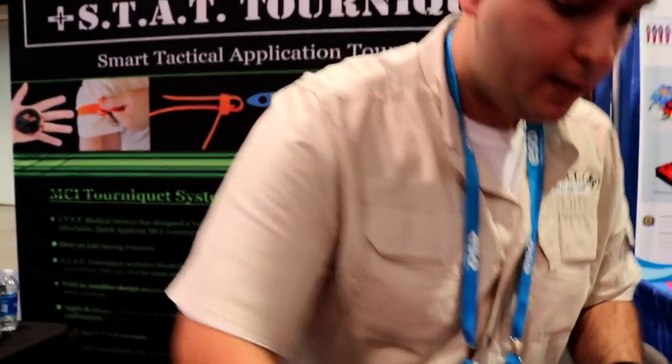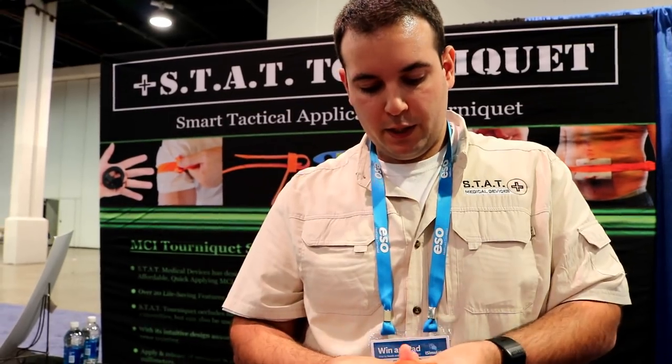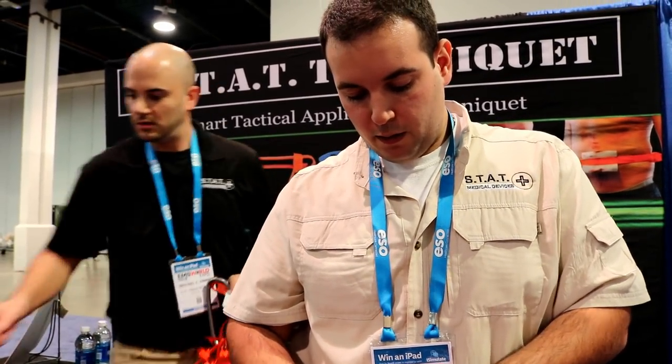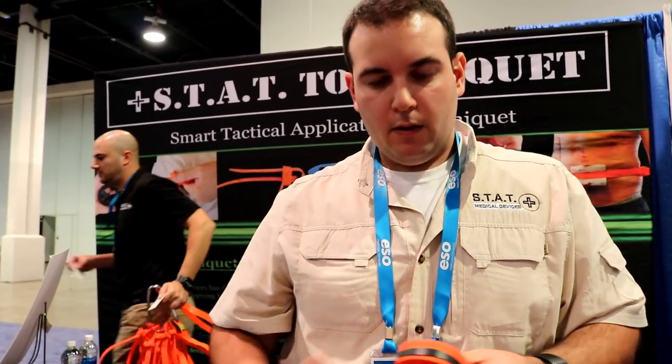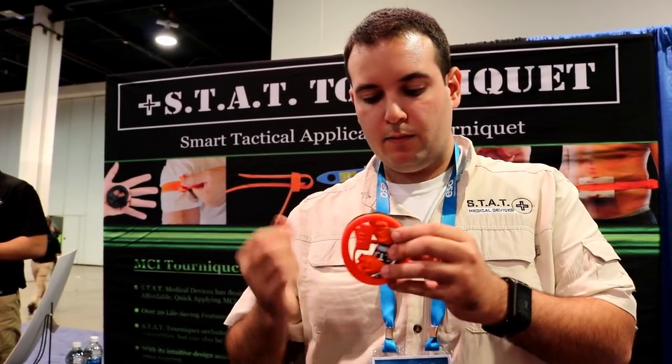We are a custom kit company. This pair of gloves, we can offer for an additional cost, pre-wrapped inside here. Let's say an officer has this in their back pocket or in their cargo pants. There's a victim on the ground and they don't want to get blood on them — obviously, that's the training. They can rip that out, put the gloves on, attend to the victim, cinch it down, and you're good to go.